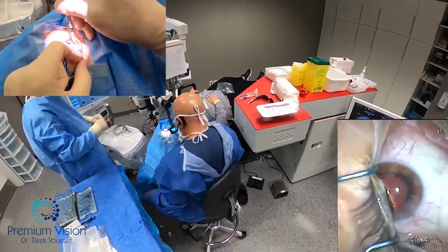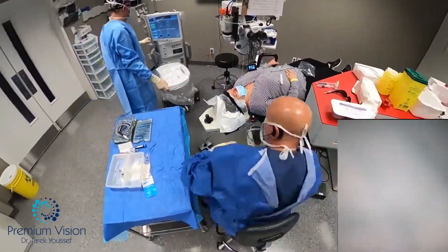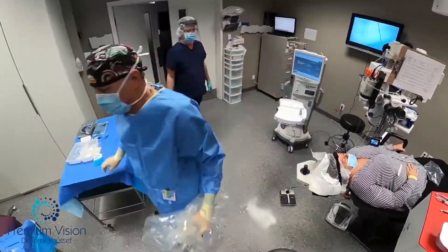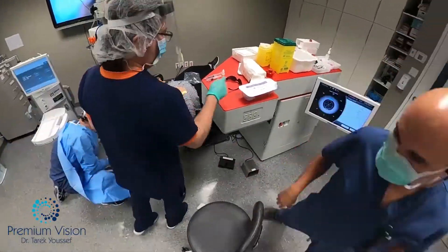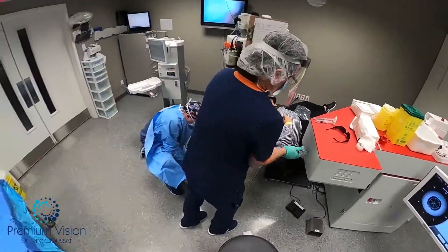Then injected the droplet. This eye is done. Now we'll tear down this setup and start a new setup for the second eye.